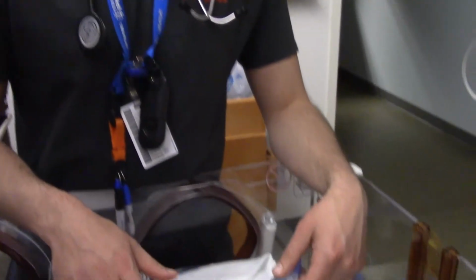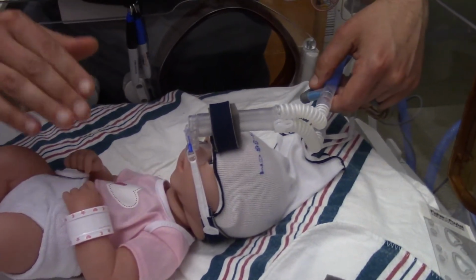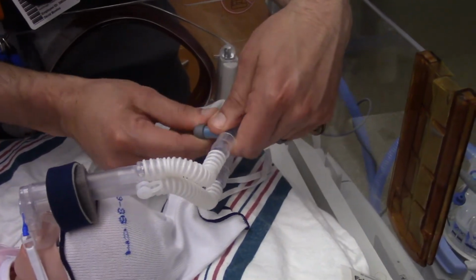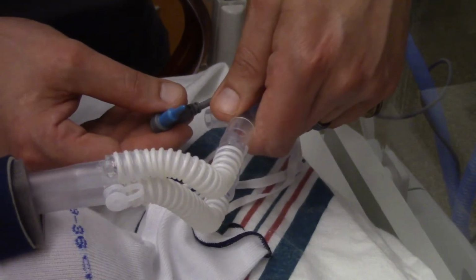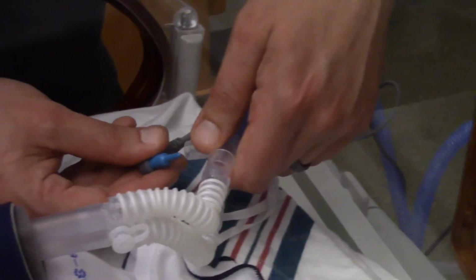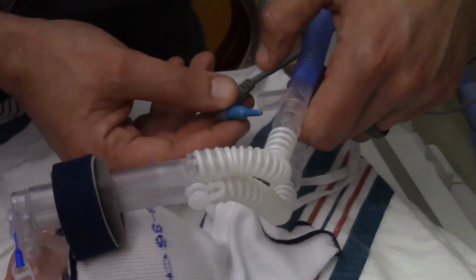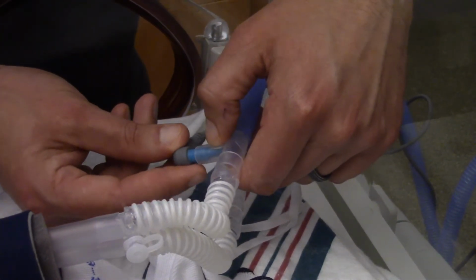If the baby is crying and it's an older gestational baby, and you as the healthcare worker are slightly concerned with a pneumothorax, you can take your temp probe and let it go. Okay, this will relieve the pressure that's going back there. Okay, once baby calms down, now all they have at this point is just their own peep. Baby's calming down, they're looking a little better, they've got their binky, their sweetums, whatever it may be.